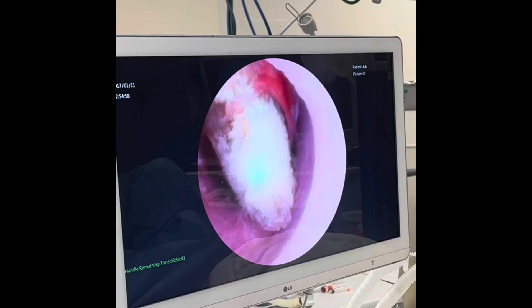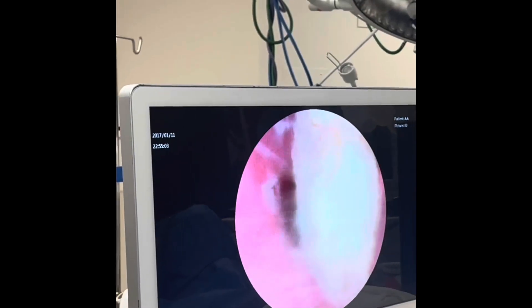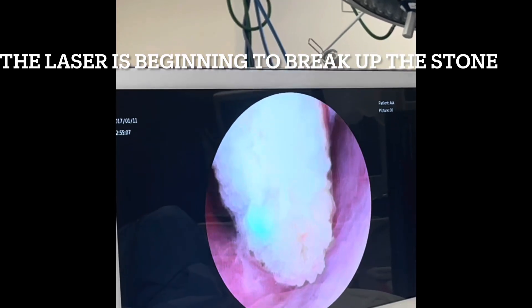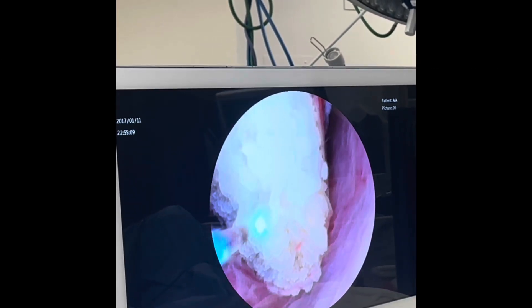We're about to start the laser of the stone. The pink mucosa is the inside of the kidney, and the yellow is the stone. And then shortly you're going to see the Thulium laser fiber.